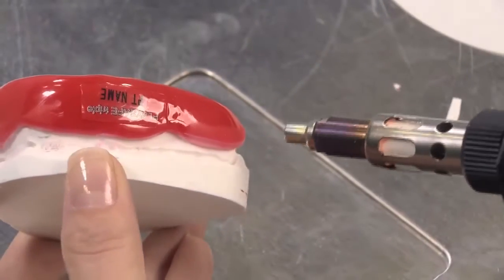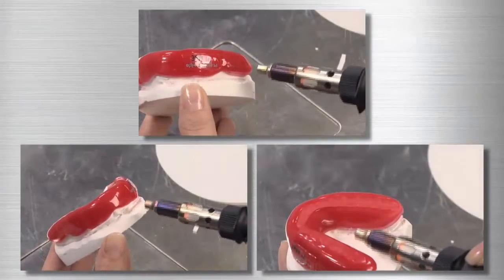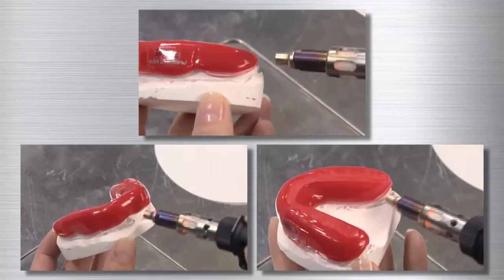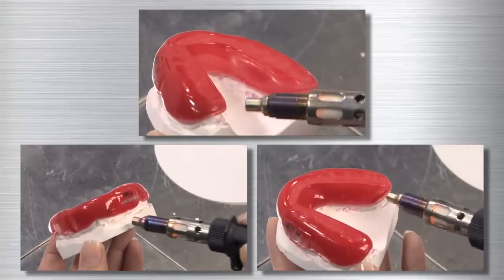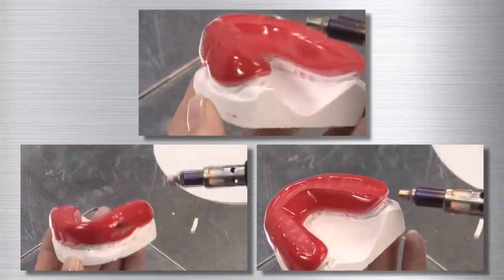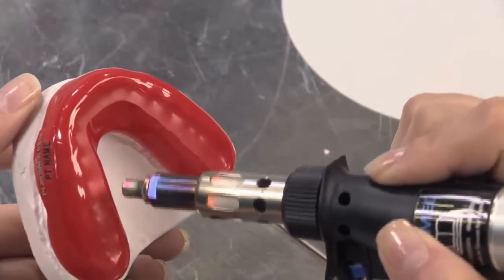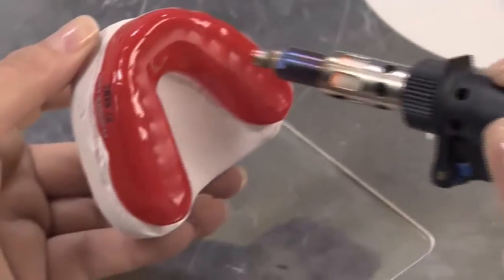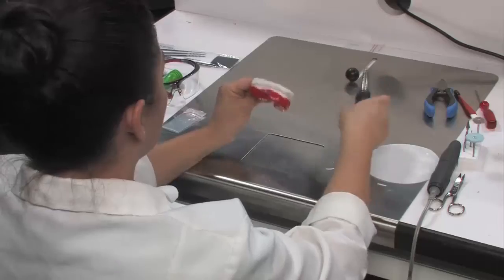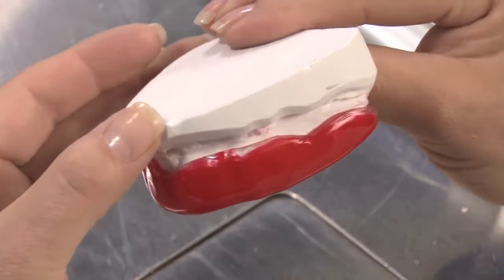After the label has been properly attached, use the hot air pen to polish the remaining portions of the appliance. Start at one end and slowly work your way around the entire edge. Finally, make a few quick passes over the occlusal surface of the appliance where the bite spacer was placed. Inspect the appliance to ensure there are no flaws.